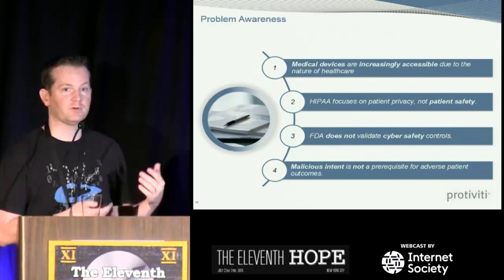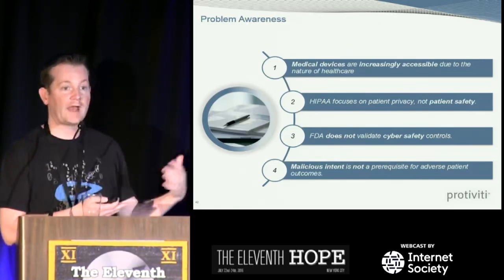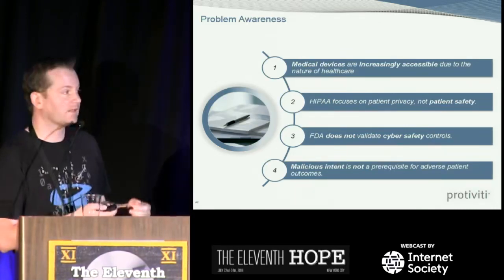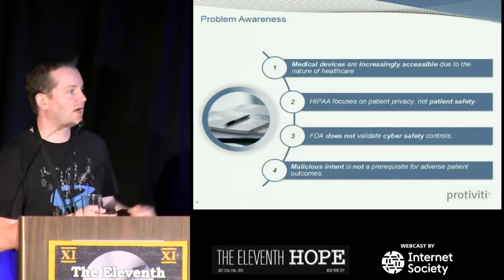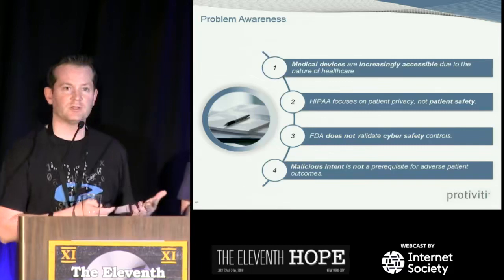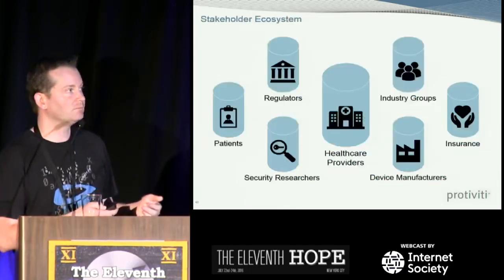I think a lot of people, especially new to this, might think the FDA should be or has been validating cyber safety controls on all these devices. That is not the case. And as we talked about, malicious intent is not a prerequisite. So it doesn't really matter whether or not you believe people are out there trying to do this to cause a potential negative outcome.